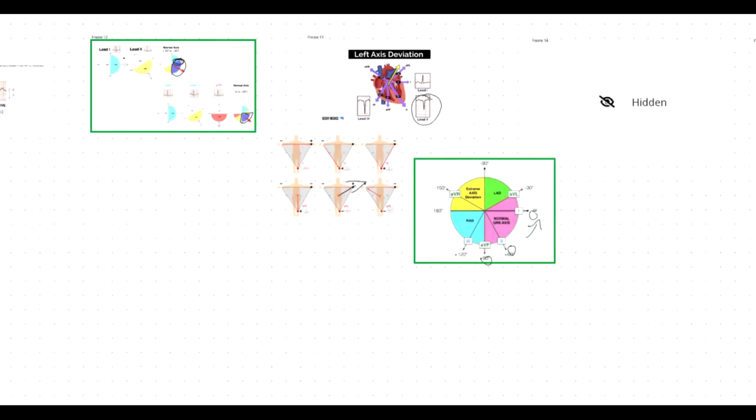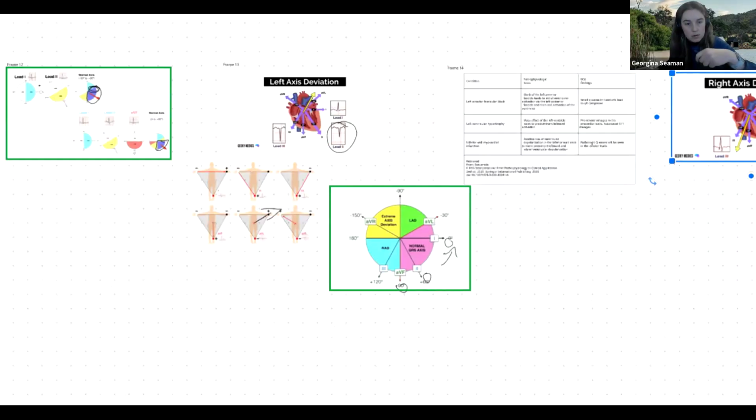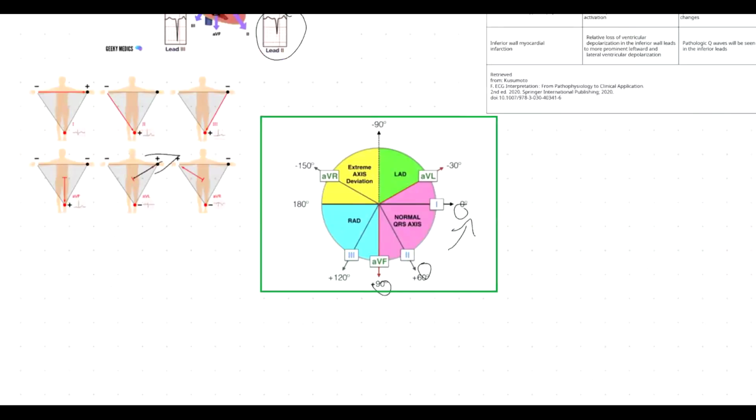Sorry, just to recap that. If the AVF begins looking like an AVL, that could indicate left deviation, but if it starts looking like an AVR, it could be right deviation. So if it starts looking like either of those different ones, that's what indicates it. Is that the summary, or did I get that wrong?